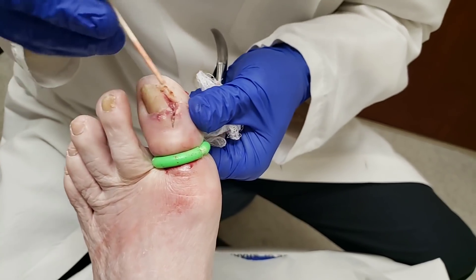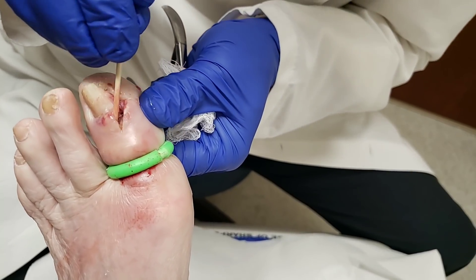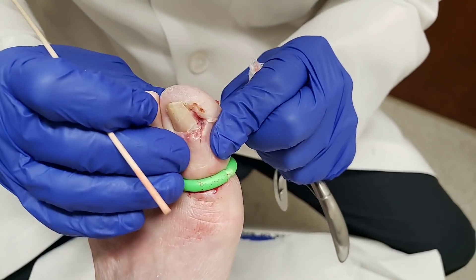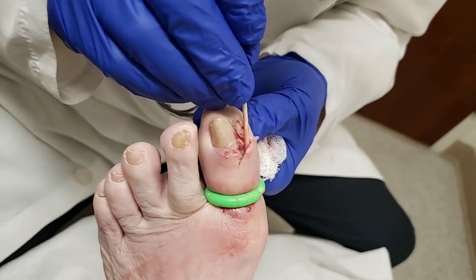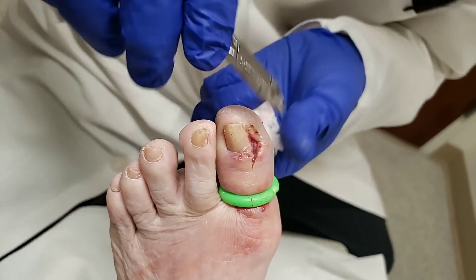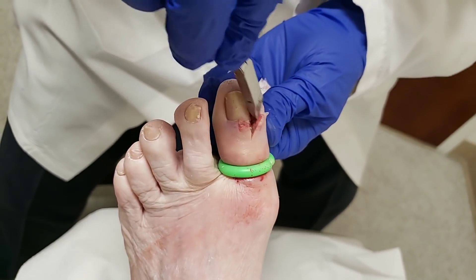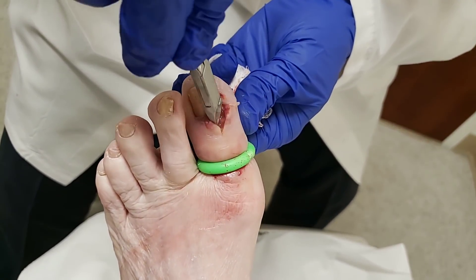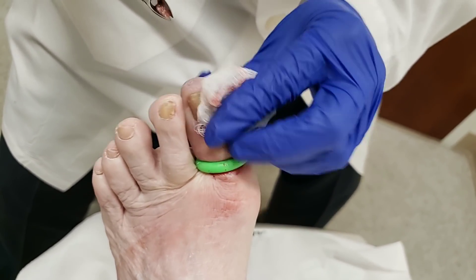The purpose of this is to really clean out all that pus that might be in there, and all that bad tissue. All this is just bad, dead tissue, and we like to try to remove as much of that as we can. There is a concern for this patient about it going close to the bone, which is why we got the x-ray — to see that there's no bone infection.